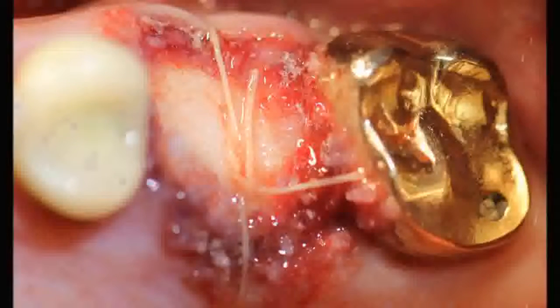The socket seal is removed in about a week, because the bond between the seal and the gingival margin is released around that point in time. We also feel that using the socket seal produces a better healing result. When you remove it, you may see a fibrin clot or immature connective tissue, but the graft is in place and the regenerative process is well underway at that point.